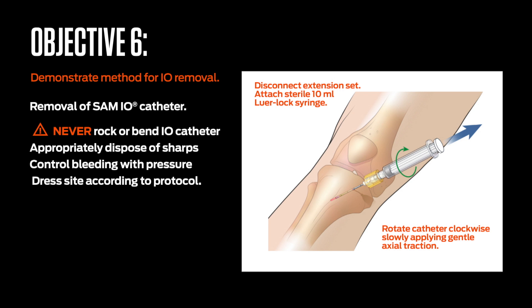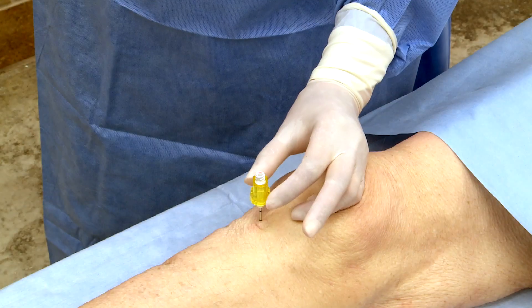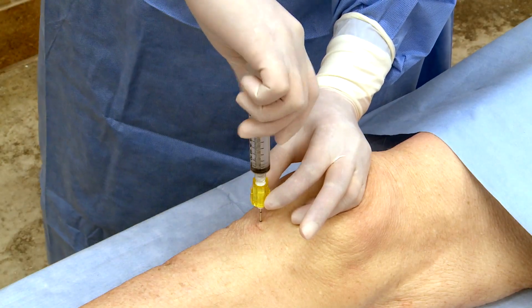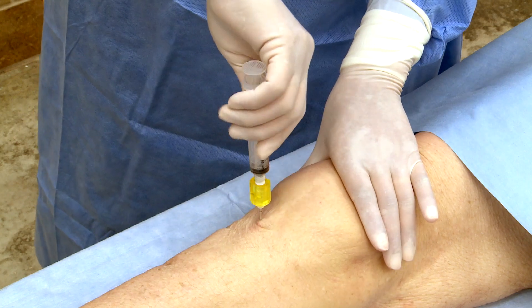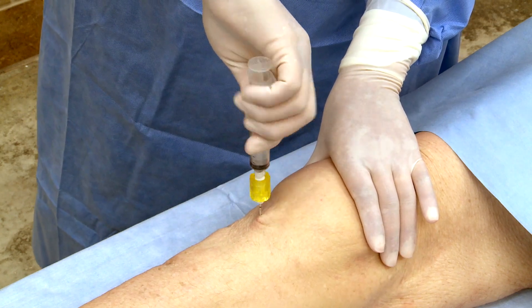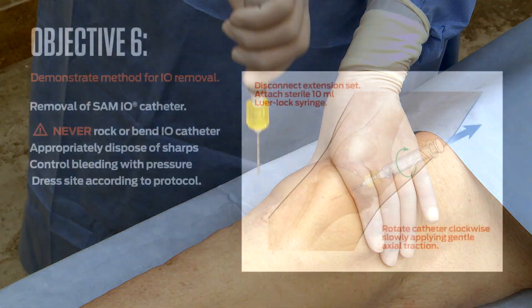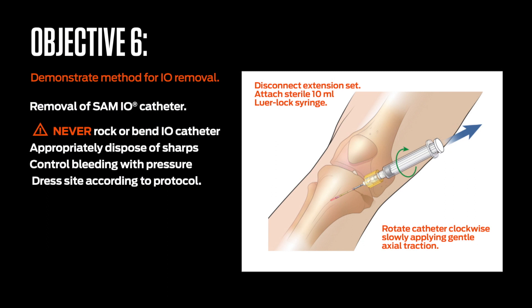To remove the SAM-IO catheter from the patient, disconnect the extension set. Attach a sterile 10 mL Luer-lock syringe to the hub of the catheter while continuously rotating the catheter clockwise to the right. Slowly apply gentle traction and maintain axial alignment during withdrawal. Do not rock or bend the catheter during the removal process. Once the catheter has been removed, immediately place the syringe and catheter in an appropriate sharps container and dress the site according to protocol or standard.